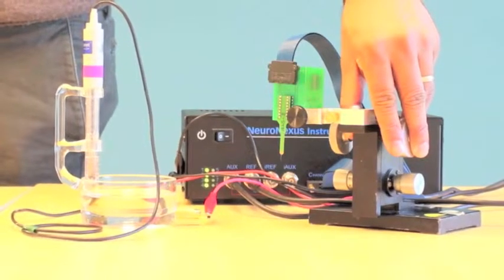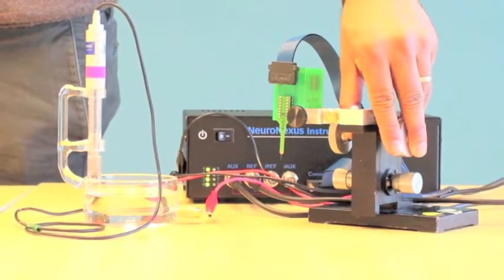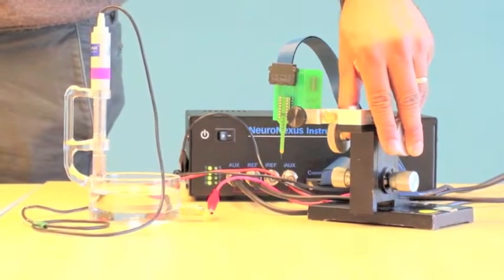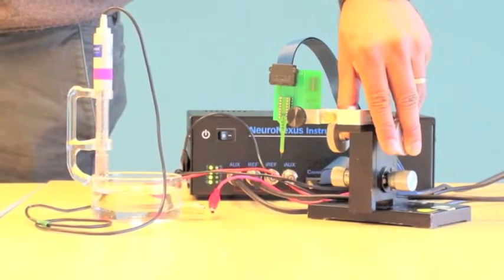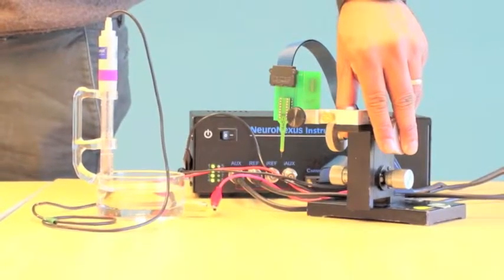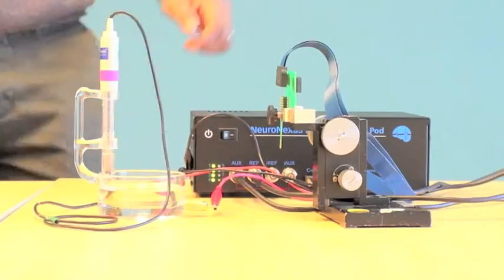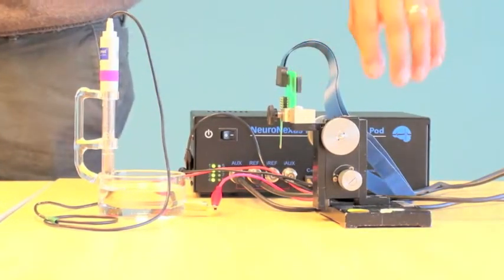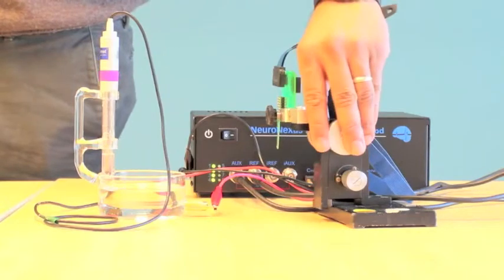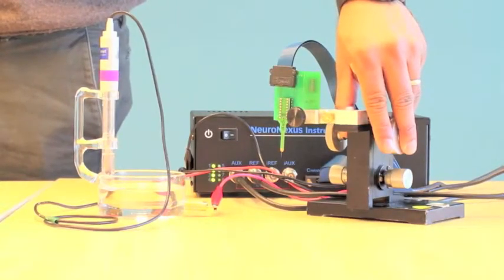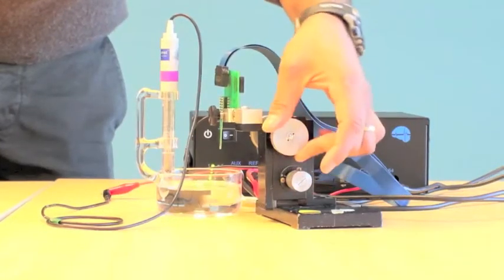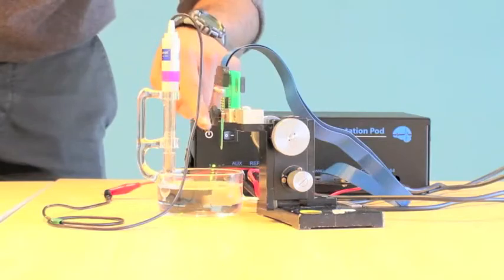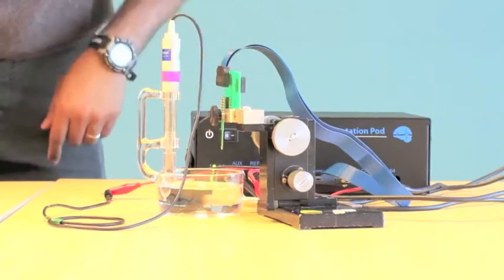Fill the glass dish with electrolyte solution. NeuroNexus recommends using .1X PBS. Connect the blue cable to the probe adapter and plug in the probe. You may mount the adapter to a manipulator to lower the probe into the dish and you are ready to begin.